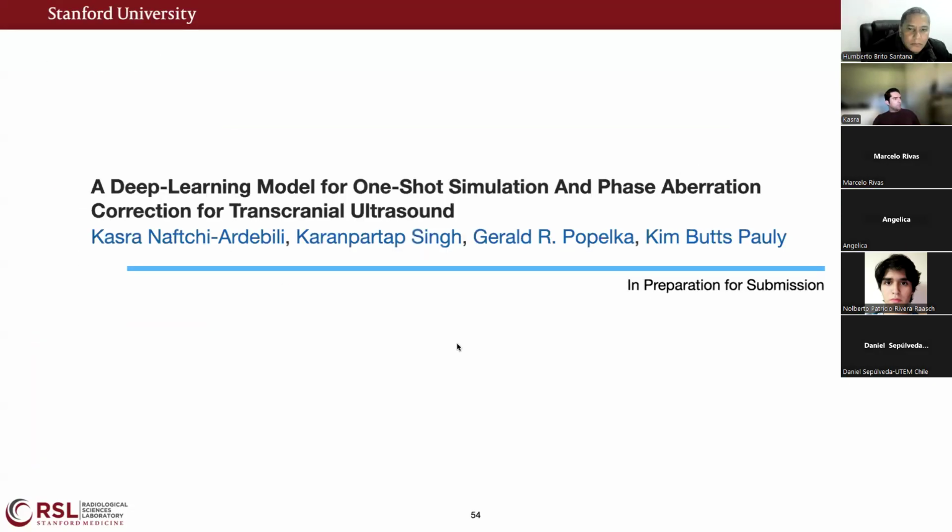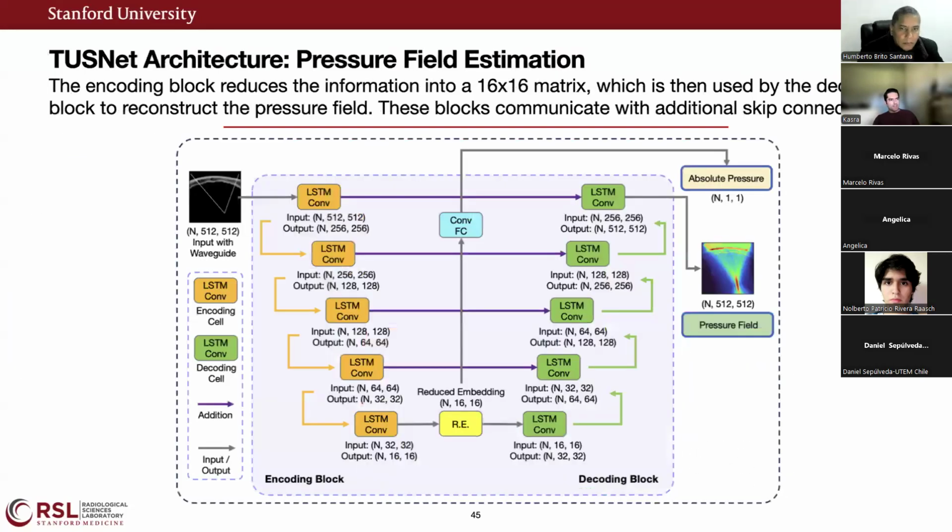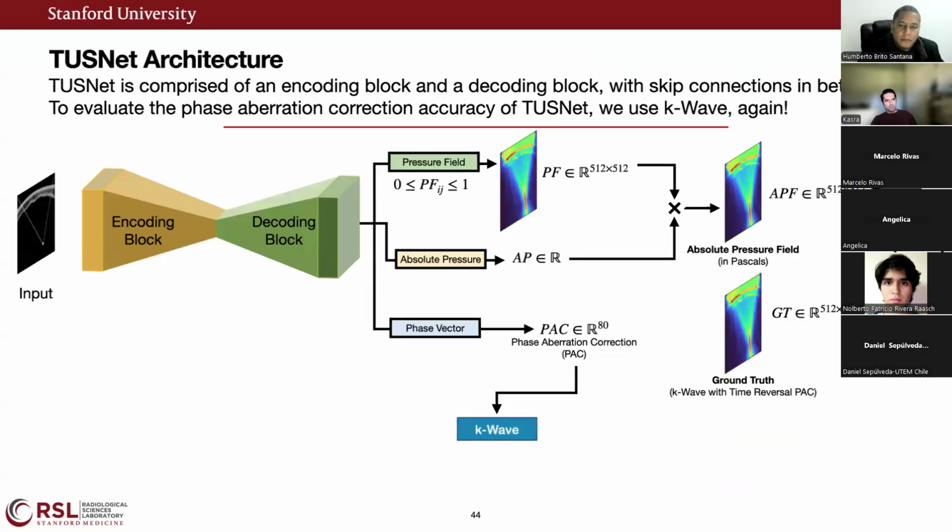That's a great question. In terms of the work we have done with TUSNet, we can't apply this to clinical trial just yet because everything I presented here is in 2 dimensions. And to be perfectly honest, as a research lab, we don't have the money to be able to train this for 3 dimensions because we would have to have GPUs. These were already trained on GPUs.